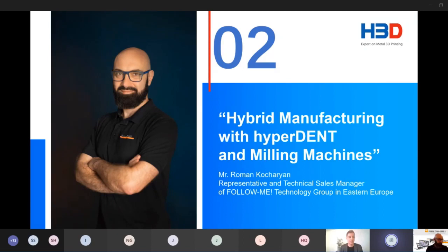There was a question yesterday. You asked me regarding dental machine G5. Can I ask for you now? Sure. It was a dental machine G5. They want to know if they can use it for hybrid production. I can tell you guys that unfortunately the dental machine G5, or any kind of dental machine, can't support touch probe. So unfortunately, we can't do that.